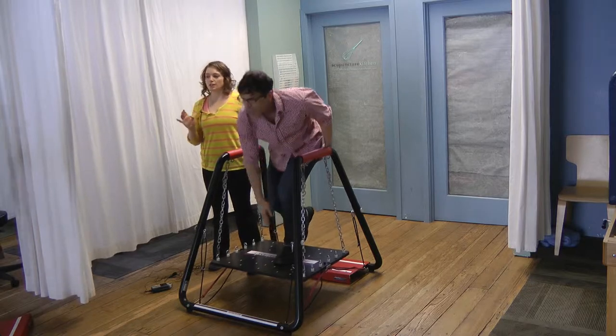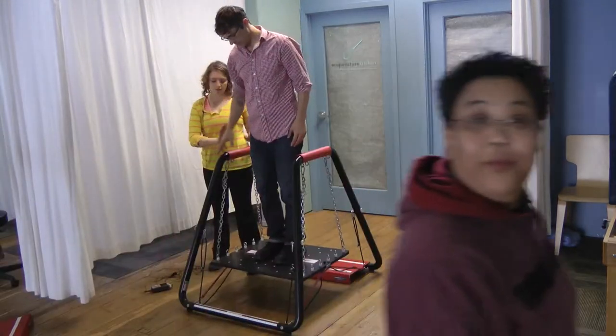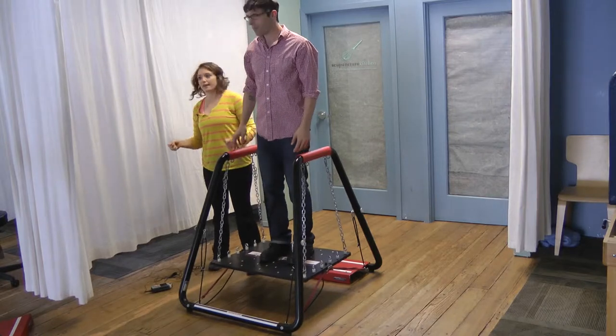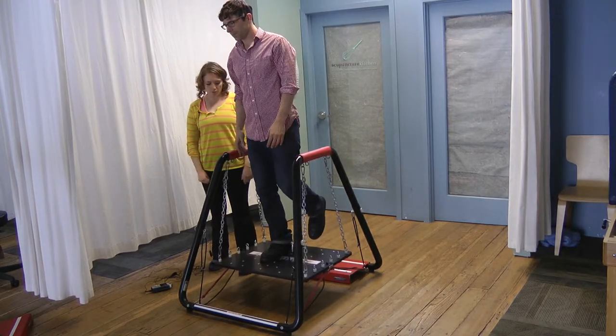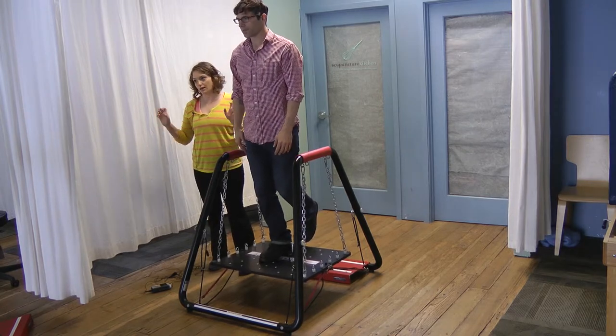Especially our older patients — when we have them doing a little bit more dynamic things in here, they like that the bars are so close so they can either lean into it or hold on to it. They're right there, which makes them more comfortable while doing a possibly scarier exercise.